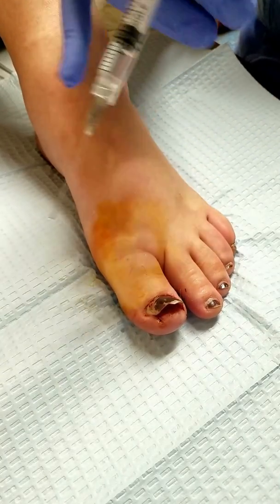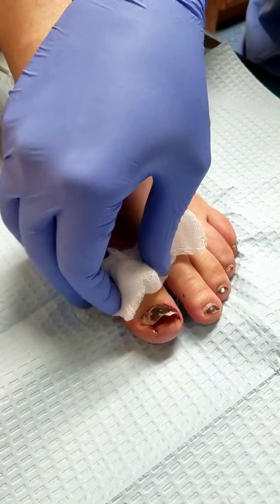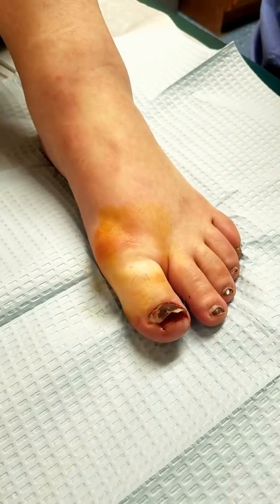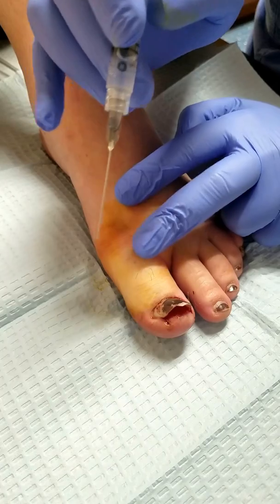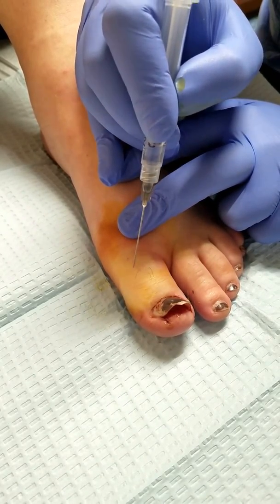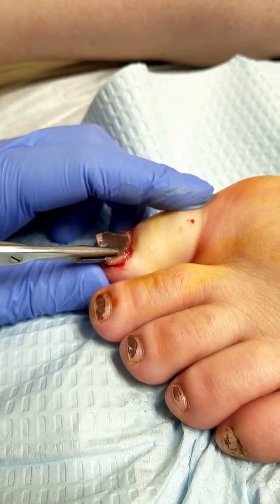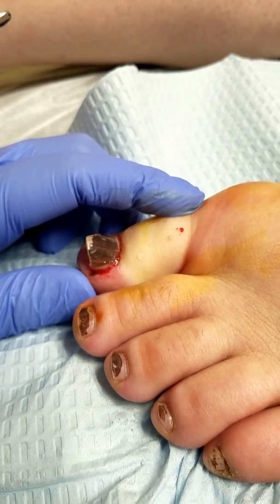Your toe should feel like it's completely asleep. Does your whole toe feel fat and numb? Yeah, good. So now we're going to test the ends of it — you tell me if you feel dull or pokey. How about that? No. I can feel like pressure but nothing. How about on this side? Does that hurt when I do this? No. Am I hurting you or does it just feel like a lot of pressure and pulling?